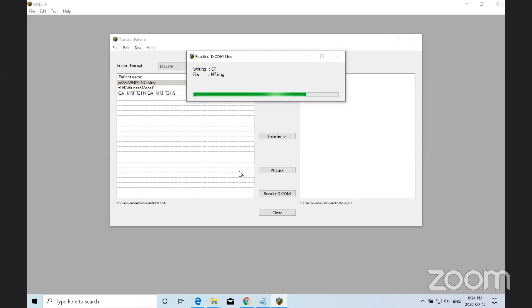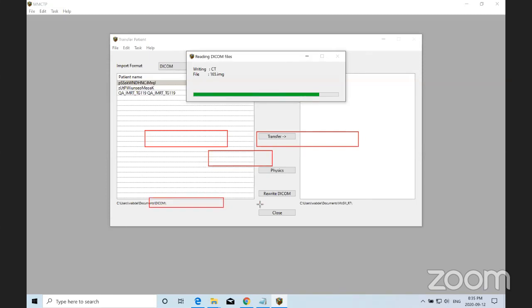Yeah, I thought so. You'd need to have some identifiers that tell the system this is the upper jaw, this is the lower jaw. What I would say is, if we want to look at how the jaws are determined, we can spend some time next week to go over that calculation and what flags MMCTP uses within the template input file to determine that these are X jaws or these are Y jaws. But if you just have some X and Y jaws in your cobalt machine, then it's very simple to apply that same method to determine the divergence.